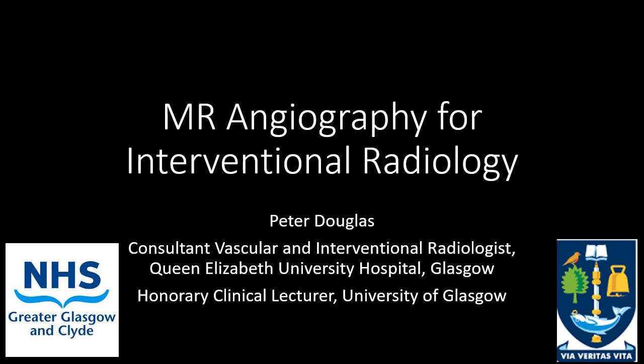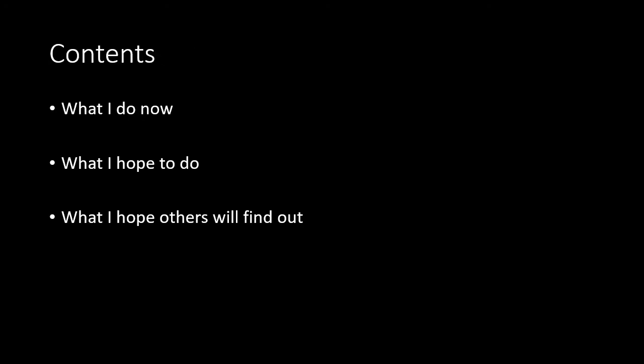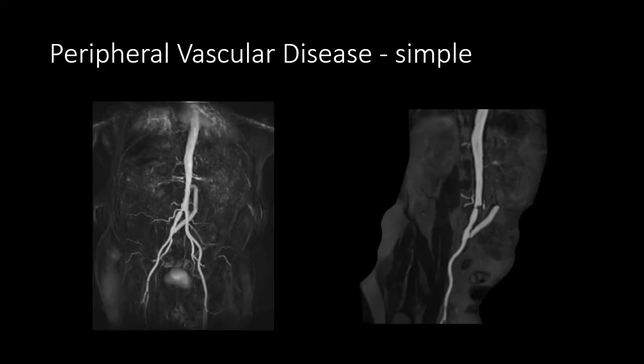I'm an interventional radiologist based in Glasgow, and today I'll be speaking about MR angiography for interventional radiology procedural planning. In a nutshell, I'll be speaking about what I do now, what I hope to do in the future, and what I hope others will find out to benefit my patients.